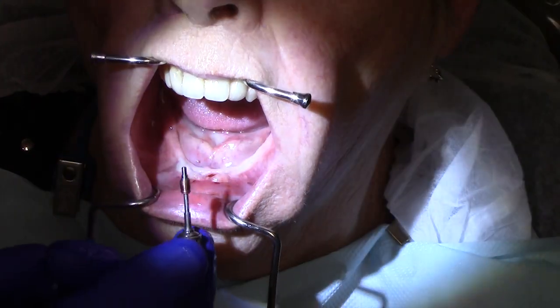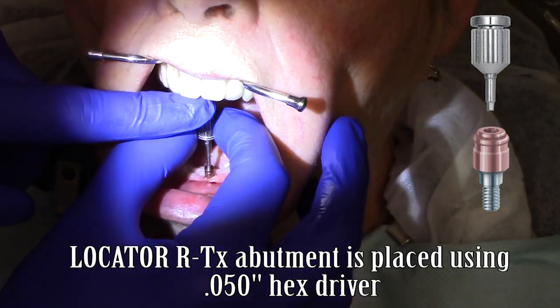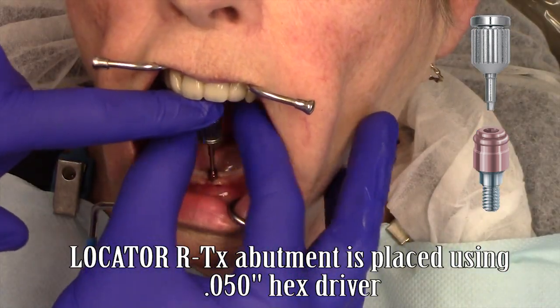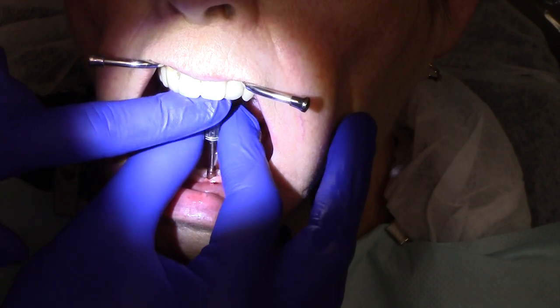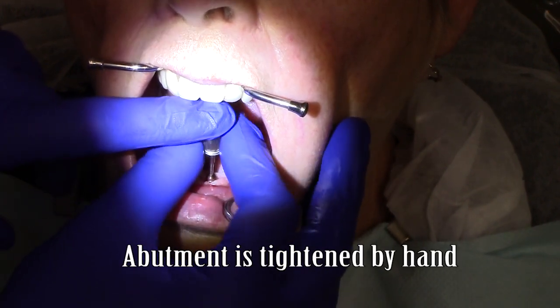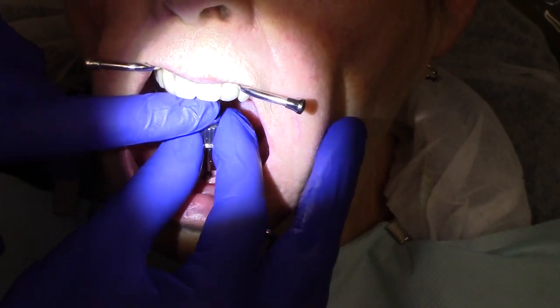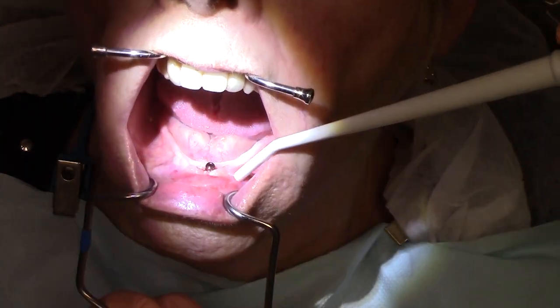The locator RTX abutment is placed using the same 0.050 inch hex driver, carefully taken to the mouth, starting by gently screwing the top portion of the screw inside the implant until the threads begin to grab. Using finger pressure, ensuring that the abutment is snug tight.